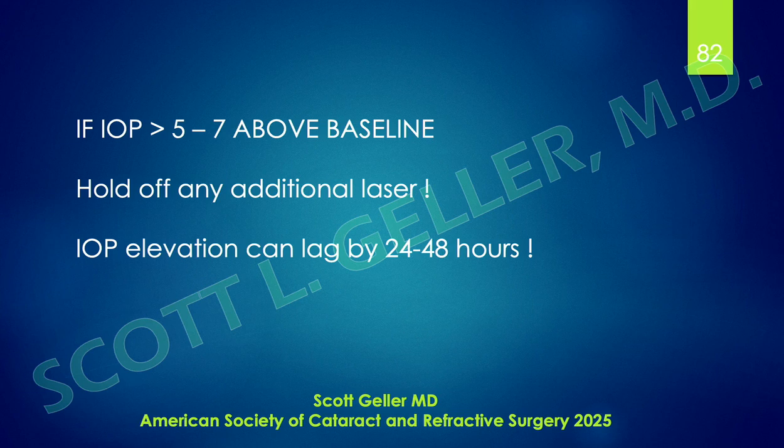That's possible that there can be. But if you have a pressure that is above 5 to 7 millimeters of mercury, above the baseline that you know is accurate, that's a red flag. This is, of course, in the post-op visit, by the way. Don't go back and do more laser on that patient. The patient may say, well, I still have this thing. It's almost gone, or it's partially gone, and we've got to do some more. Don't succumb to what the patient wants.